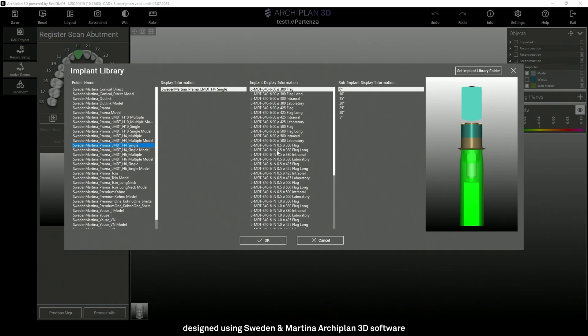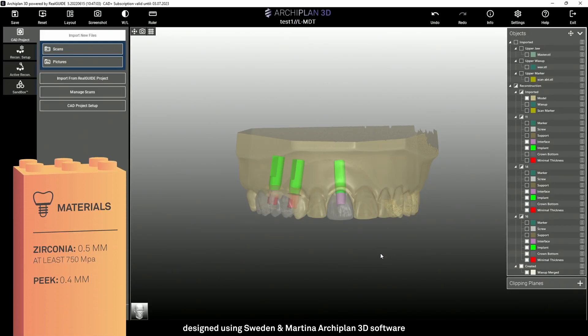We can close the prosthesis at platform level, or we can close on the neck of the implant for 0.5 mm, 1 mm, and 1.5 mm. The fourth parameter allows us to select the type of scan body. We can choose between flag, flag long, the old intraoral, and the laboratory one. In the last column, it is possible to select the angle degree of the screw channel.